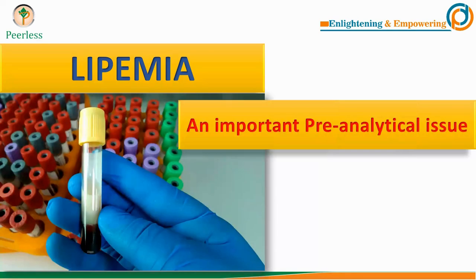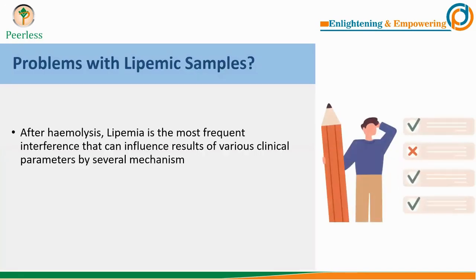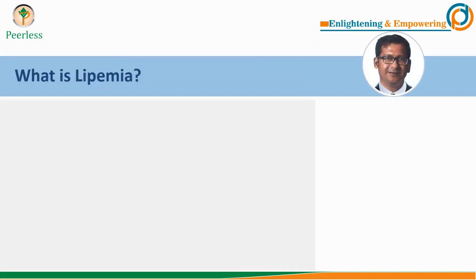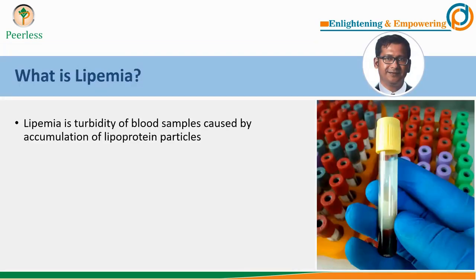Good morning friends. You are already aware that in clinical laboratory settings, interferences can be a significant source of pre-analytical laboratory errors. After hemolysis, which was discussed in the last session, lipemia is possibly the most frequent interference that can influence various biochemical parameter results through several mechanisms. Today we are going to discuss what is lipemia, what are the possible reasons for lipemia, which parameter results can be wrong and why, and how to detect and handle lipemic samples.